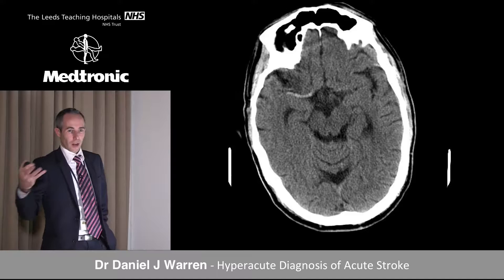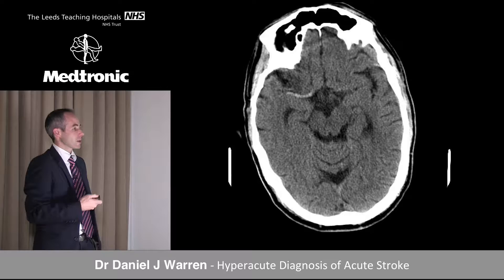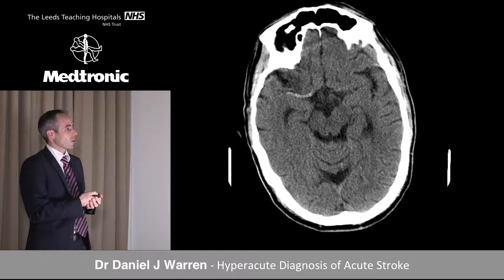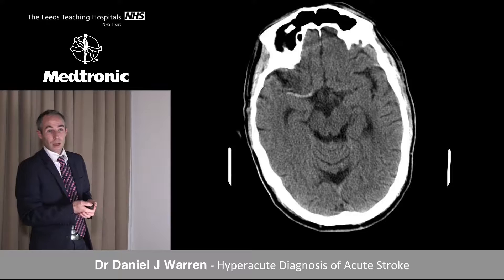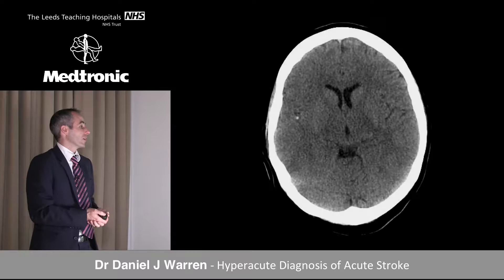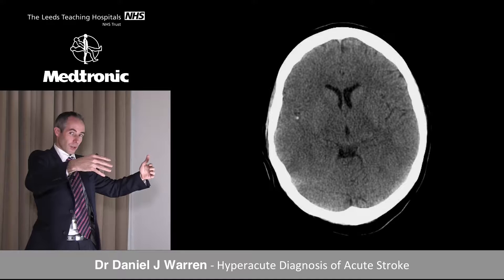Beyond the subtle parenchymal changes, vessels need close interrogation on CT. On this non-contrast study we have paired structures. There are not many things bright on CT — calcium, hemorrhage, proteinaceous material. Here there's something bright in this area. It's not hemorrhage because it's not dependent or layering against the brain parenchyma — this is a tubular structure. This is a good long length of thrombus within the proximal MCA. CT angiography would further define this.